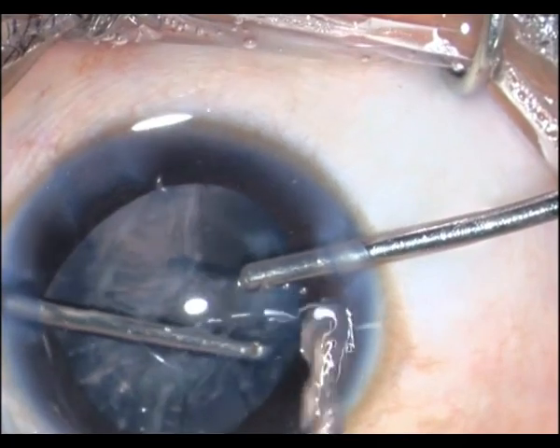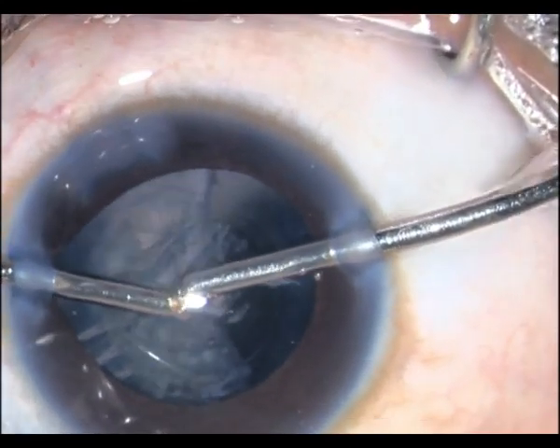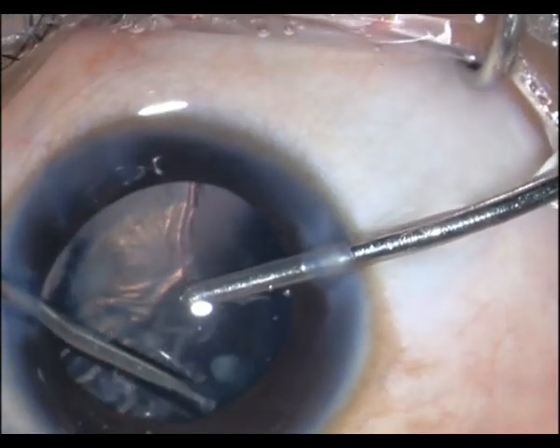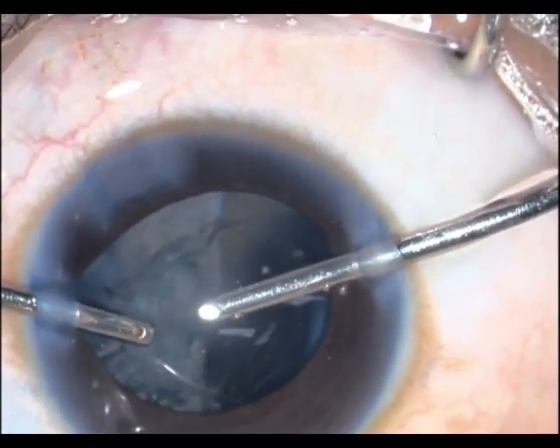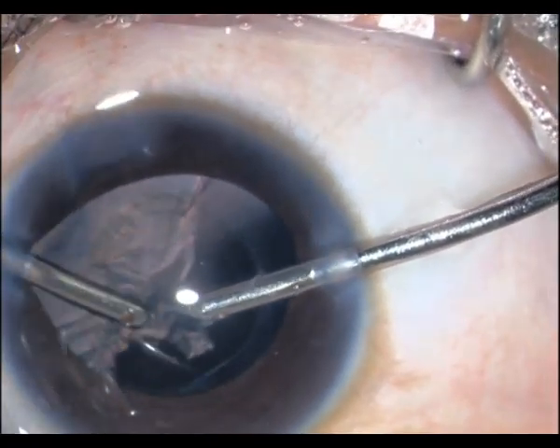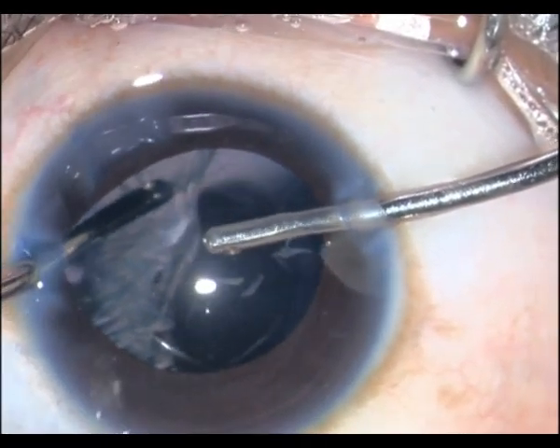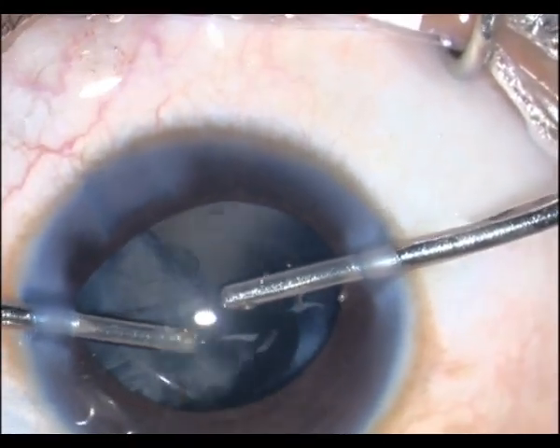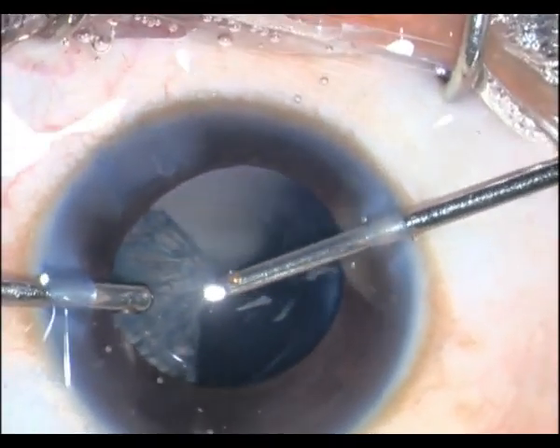It is very important to have a complete removal of all cortical material. As you know, in pediatric cases there is almost a hundred percent chance of posterior capsule opacification. And even with all this removal, since this child is below four, you need to do a posterior capsulotomy and remove the anterior vitreous to knock off the scaffold and prevent an after-cataract in these children.